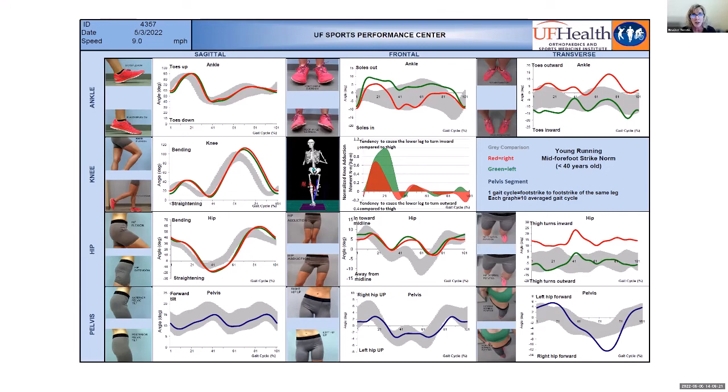But what we have here is during a typical gait cycle, from foot contact to loading, push off, swing, and all the way back down to foot contact again, what is your body doing? And how does your motion look? Is it symmetrical between the right and the left side, which on these pictures are the colored lines? That's Brady. So his right side is in red and his left side is in green. The colors only mean left and right.